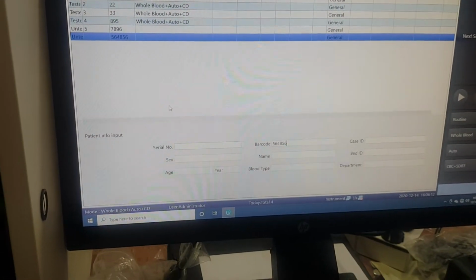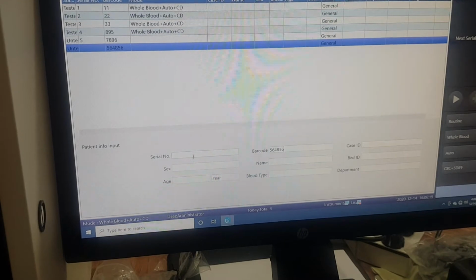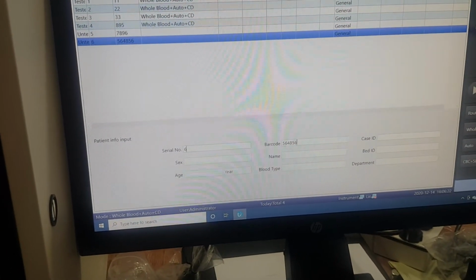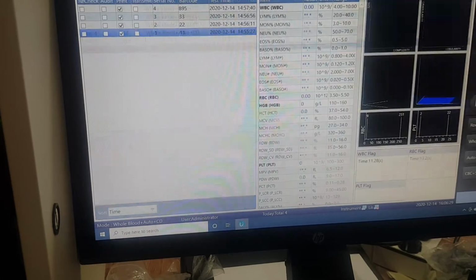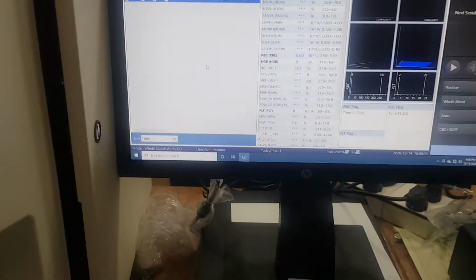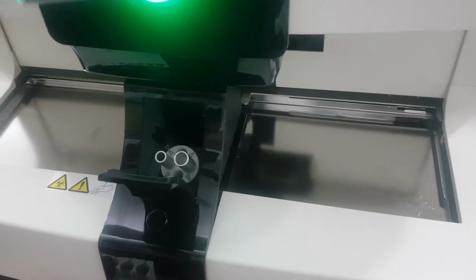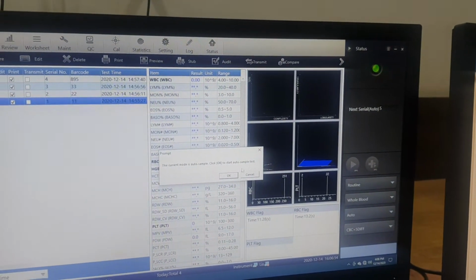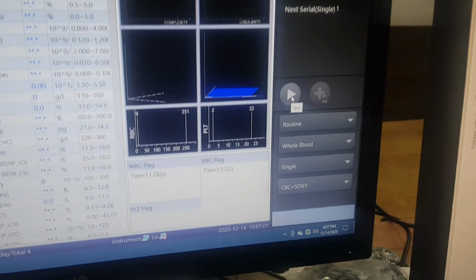Then when we run a sample, let's see if we put number 6 here, and save, and we go here, and when we want to run a sample in manual mode, so we open this one, we put a sample here in manual mode, and we close the door and we press count. So okay, we have auto here, so no, we cancel, we select single, we select auto.